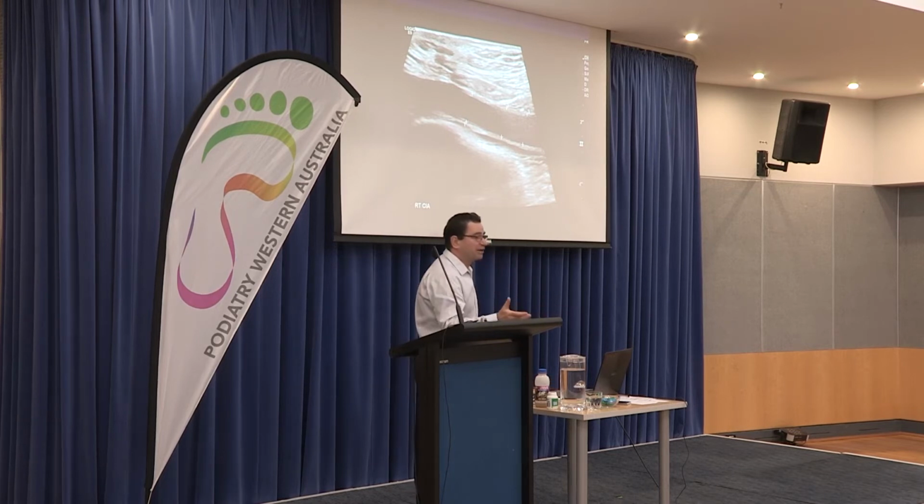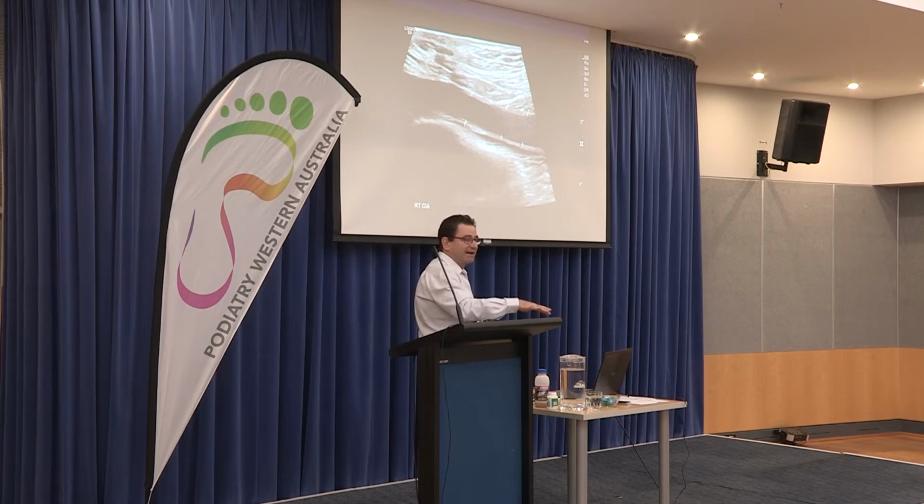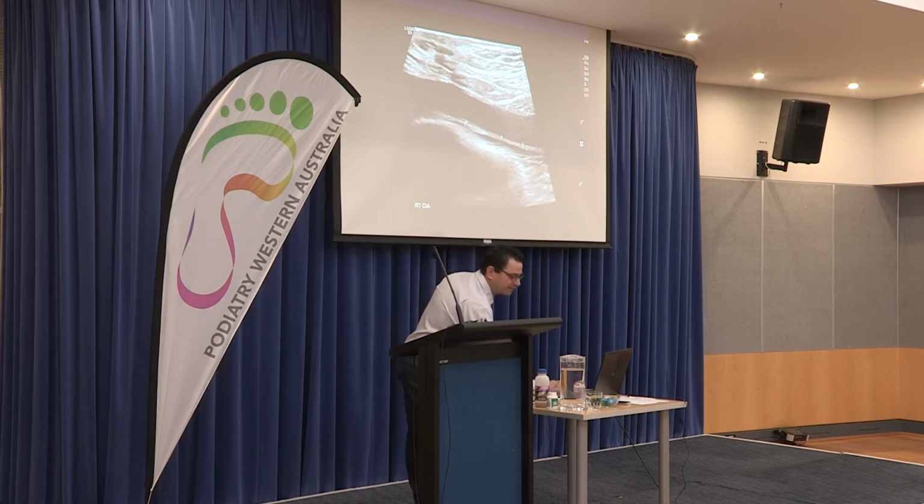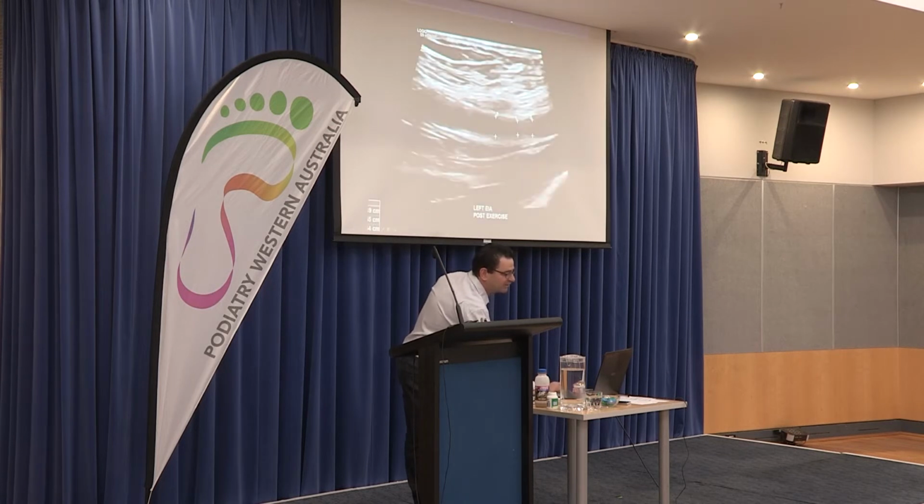Be that as it may, she actually brought her machine into the practice. We stuck it up next to the ultrasound machine. She jumped on, rode a pretend few kilometres, and then jumped back onto the scanner. And then you can see how the iliac artery narrowed down a lot, which I measured, but that's neither here nor there.